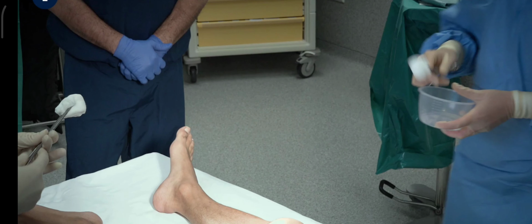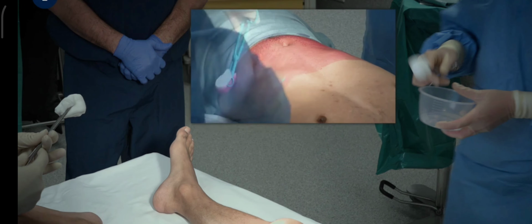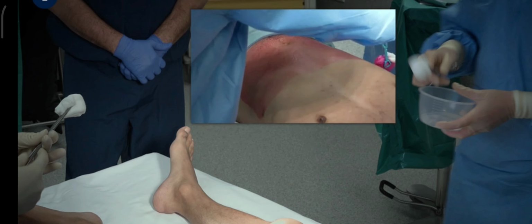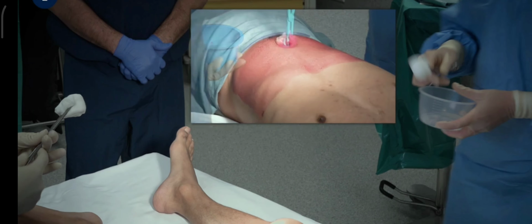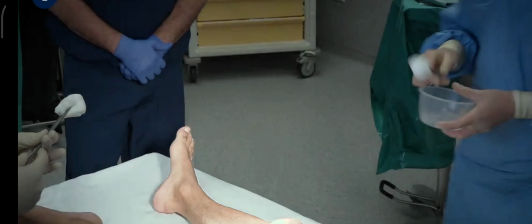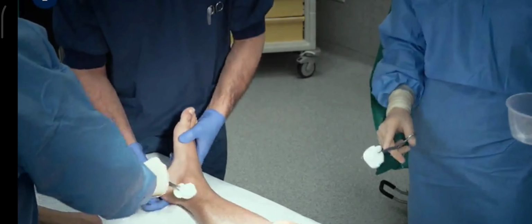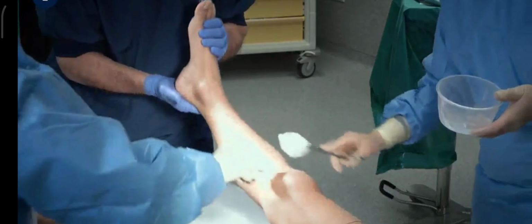In this film, cleaning and draping techniques will be demonstrated on different parts of the body using a patient model. To expedite instruction, chlorhexidine with tint will be seen used only on the abdomen. Elsewhere, the area to be cleaned will be demarcated using a highlight, and cleaning then simulated as shown. This allows the view of landmarks and structures to be maintained.